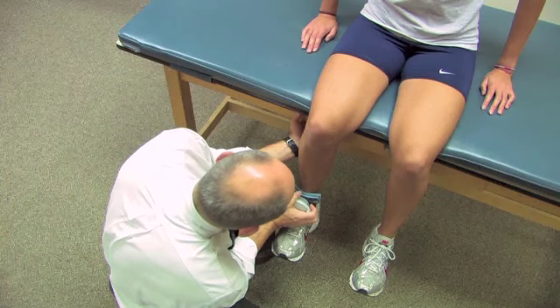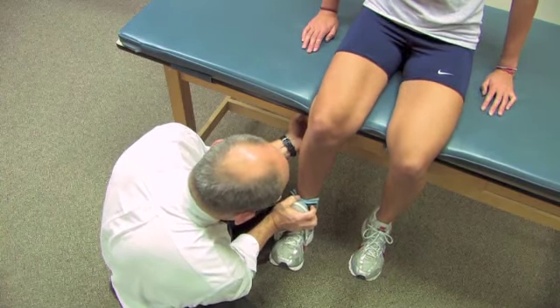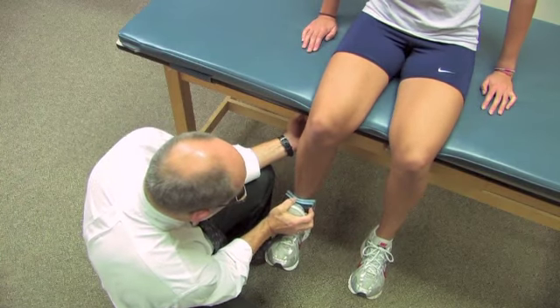Okay, ready? Go ahead, push it out. That's it. And relax. Good.